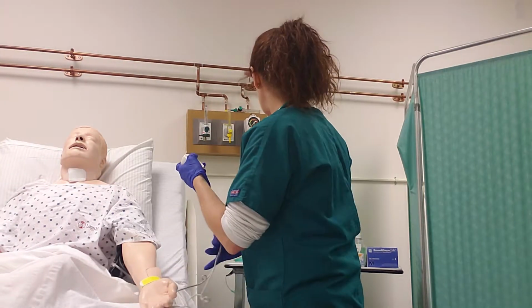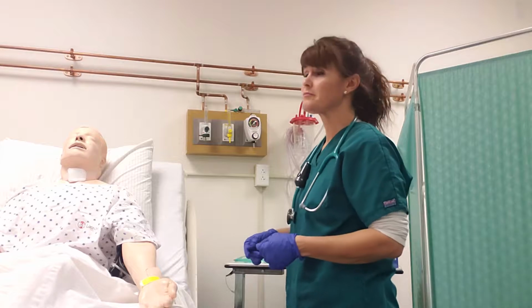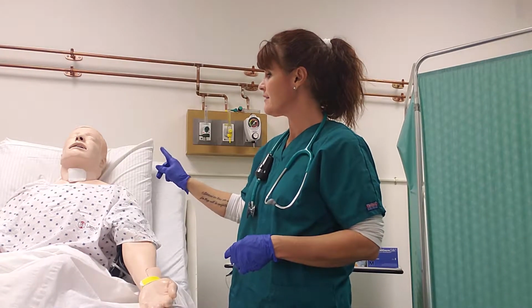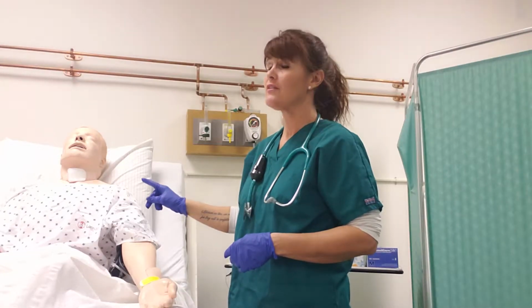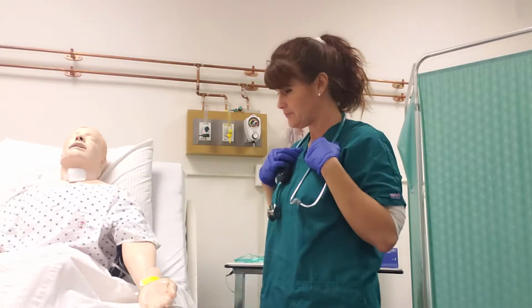All right, thank you, Mr. Wilson. The next thing we want to do is listen to their breath sounds. How that's done is you start at the top, you go side to side and work your way down. There's a total of 6 sites on the front and a total of 8 on the back.